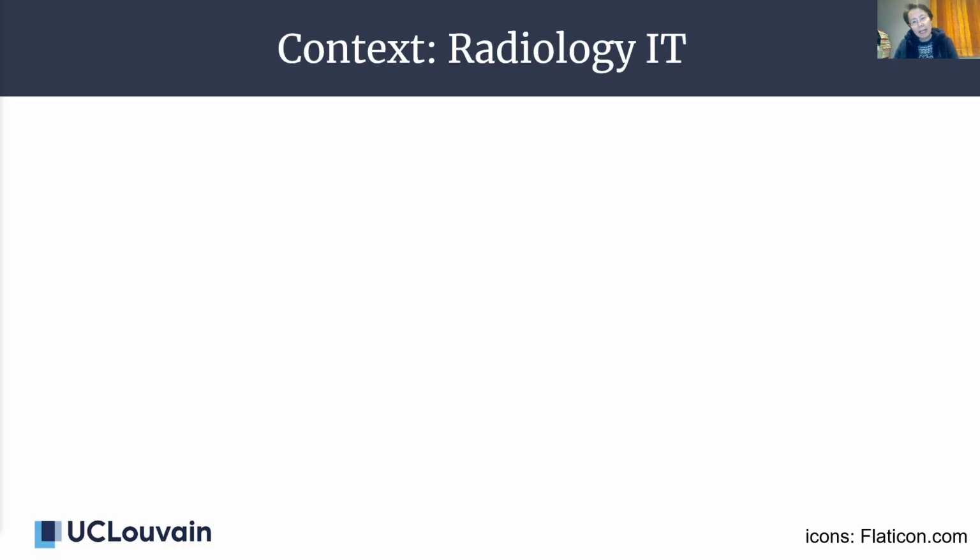I would like to show you how the IT infrastructure of a hospital with a radiology department could look like. It contains multiple components or subsystems.